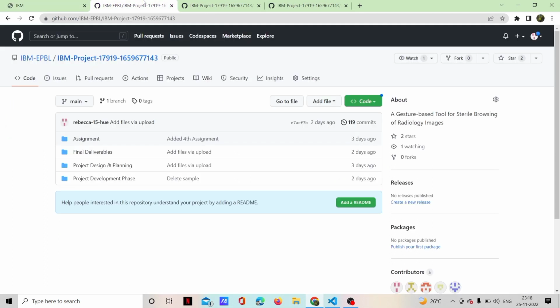Next, let's move on to the coding part. The Python platform we used is Jupyter Notebook. So this is our Git repo where we have uploaded the source code for our project.